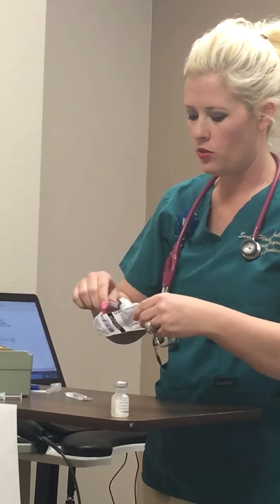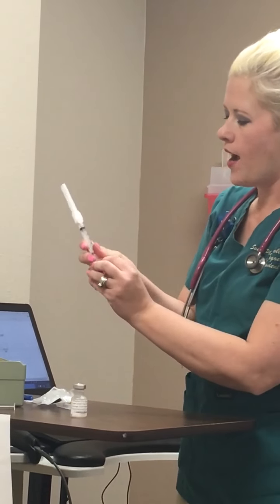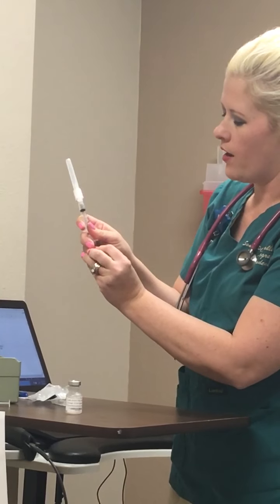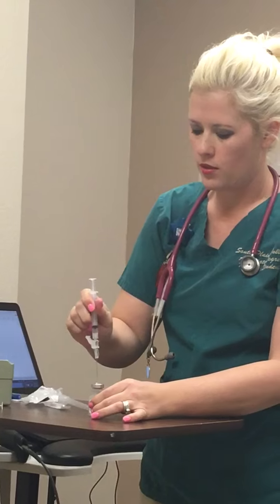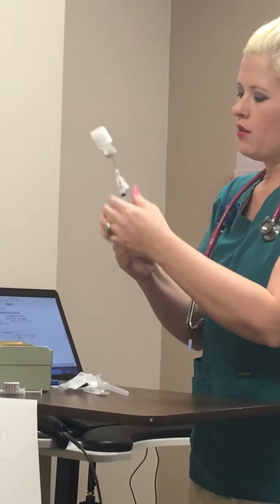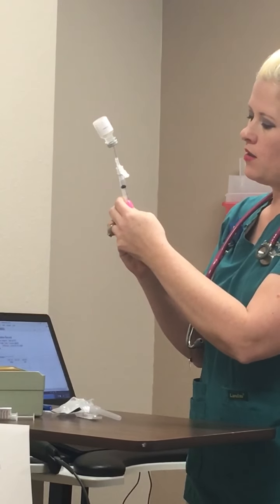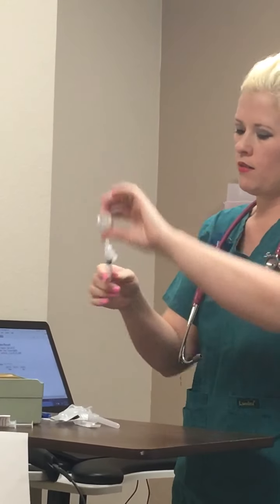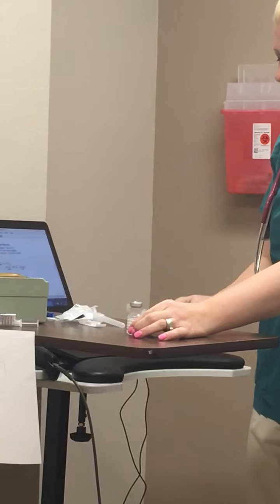I'm going to attach my new syringe. I know 1 adult dose equals 0.5, so I'm going to pull 0.5 of air into my syringe. I'm going to puncture the vial, push my air, going to pull back 0.5 mils. Okay, I'm going to take it off. I'm going to activate my safety device.